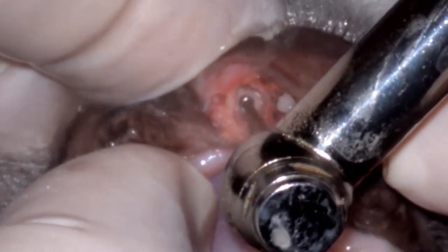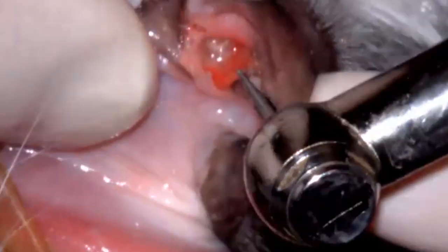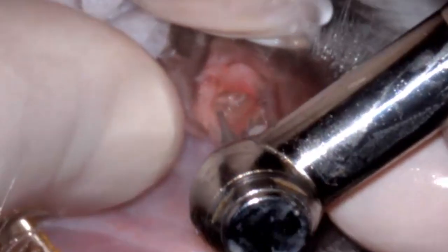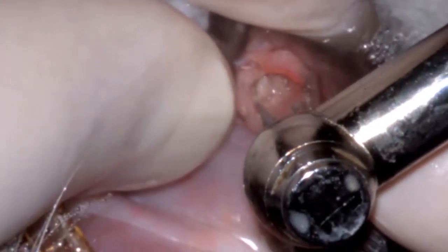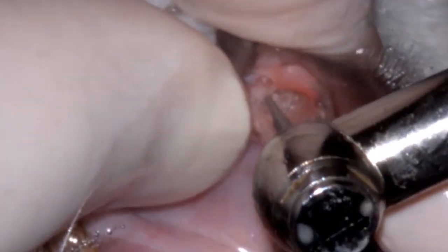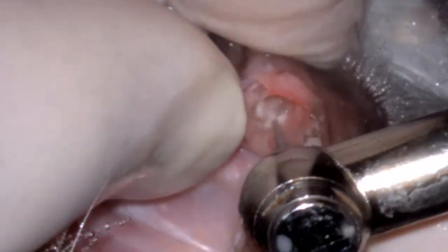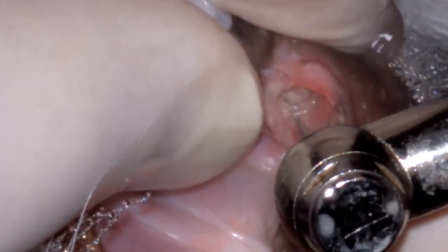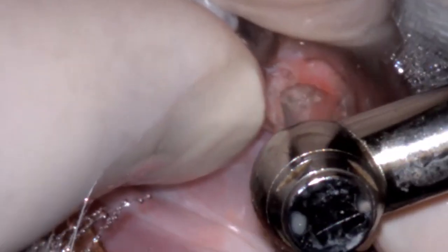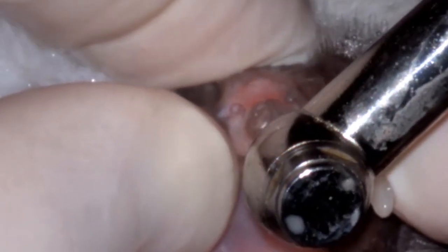Using a little blast of water to flush away debris, now I've got my number 1 half-round burr again and I can continue working my moating action around that root remnant, which is clearly visible with my headlight and magnification. I do a little moating around the root, working my way deeper into the socket, always being cognizant to remove as little bone as possible. I'm still concerned about the potential for fracturing the jaw through the socket, so I'm trying to preserve as much bone as I can and maintain the integrity and strength of the mandible while still removing this persistent and stubborn root.